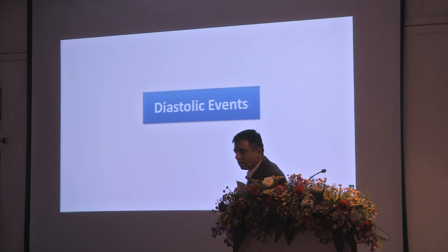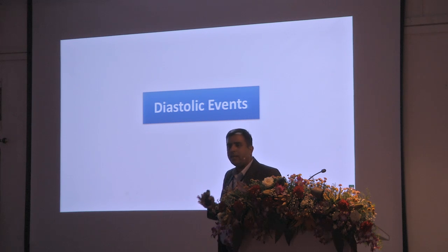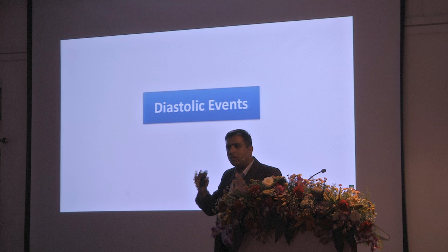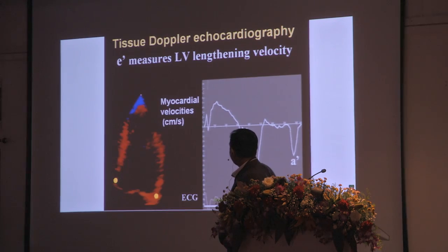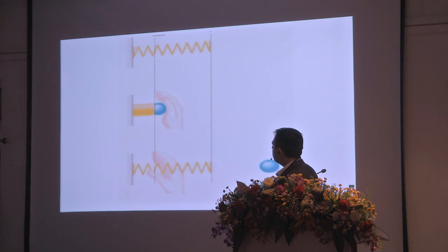Diastolic events, I'm not going to spend another hour on this, so I'll quickly go through this. The nice thing about E by E dash is that all of us have come to know and understand diastolic events a lot better. And I think Srikanth here will be able to explain these things far better than I will. So I will quickly run through the diastolic E and A, which you will see.